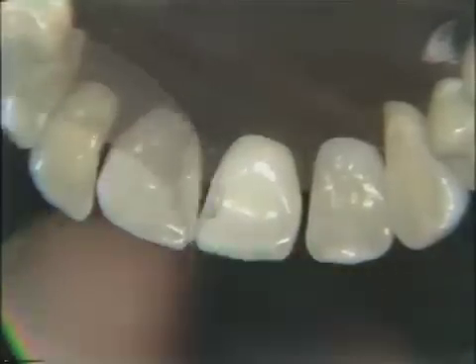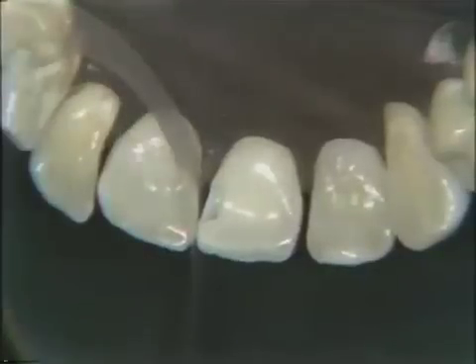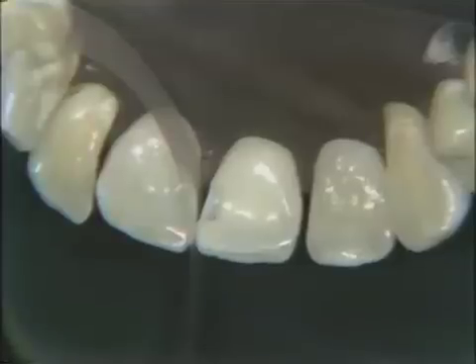Back goes the strip. We know now how we're going to adapt this strip. We place it in place before we start mixing or getting anything out on the pads. We want that in place, but the wedge is removed.